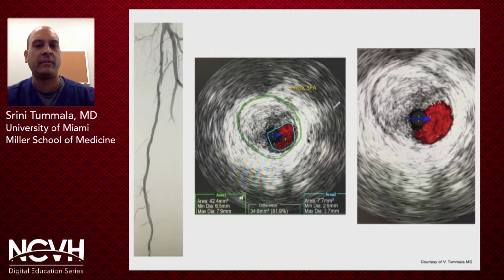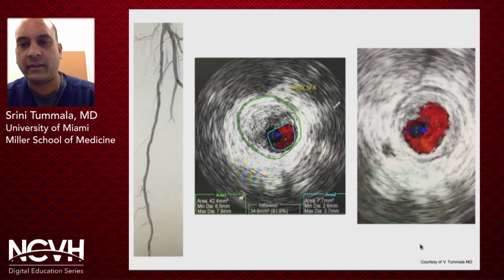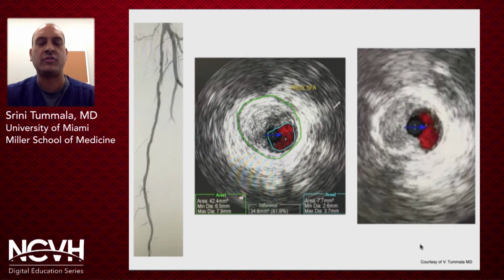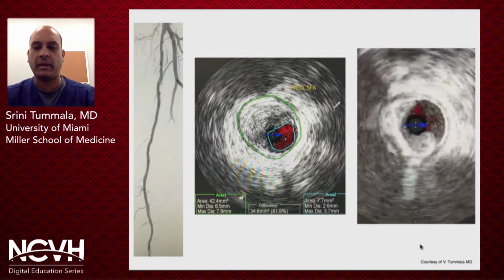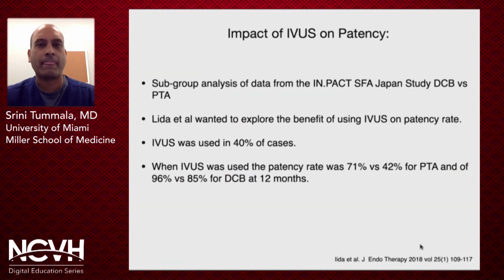But when you look with the IVUS, you can see there's almost an 82% luminal compromise or stenosis with significant atherosclerotic plaque. And in real time, if you look at this video, you can see that this is very complex morphology and plaque composition. So this clearly requires some level of intervention, whereas here, we might have just done an angioplasty. This may need something like a scaffold to fix it.